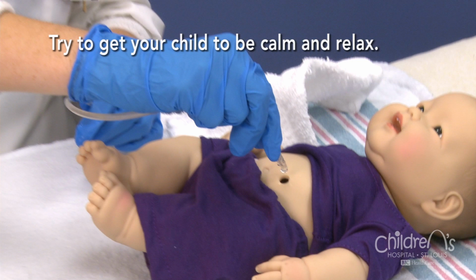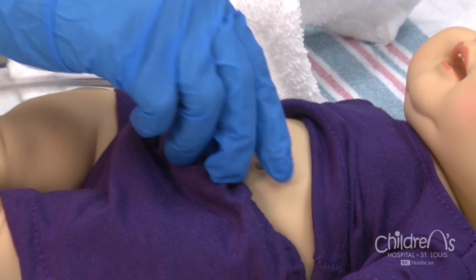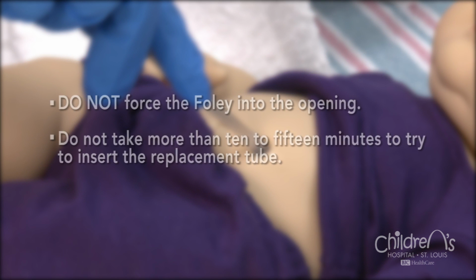Your child may cry, wiggle, or kick, which can cause the abdominal walls to tense. Try to relax and comfort your child. When your child breathes out, the abdominal muscles will relax and the Foley catheter should slide into the opening. It is important to remember not to force the tube into the hole. If you are unable to get the Foley catheter in, try the next size smaller. Do not take more than 10 to 15 minutes to try to insert the replacement tube.